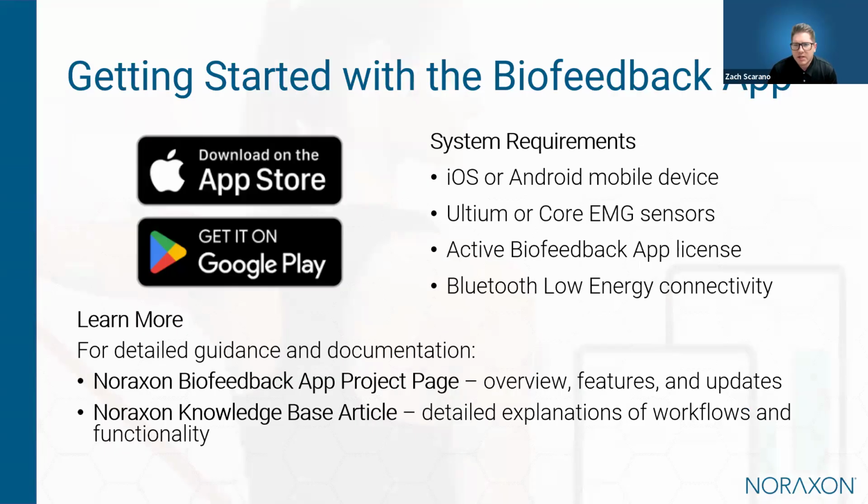And so for those interested in exploring the biofeedback app further, there are several resources available. The app itself can be downloaded directly from the Apple App Store or Google Play Store. It directly connects with Noraxon EMG sensors, both the Core and Ultium sensors, using Bluetooth. And for more detailed information about the app and its capabilities, I recommend visiting the Noraxon Biofeedback app product page on our website. This provides an overview of all the different features and will continue to be updated as new features are released.